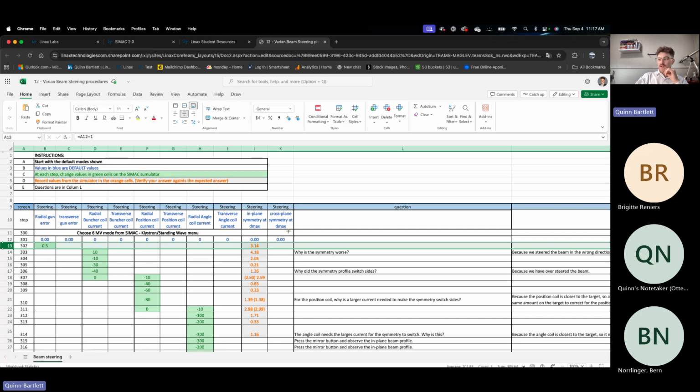This one doesn't have any questions associated with it, but then we go to our step 2 and we change our radial buncher coil current, and we get an in-plane symmetry of 4.18. And so now we have a question: why is the symmetry worse?